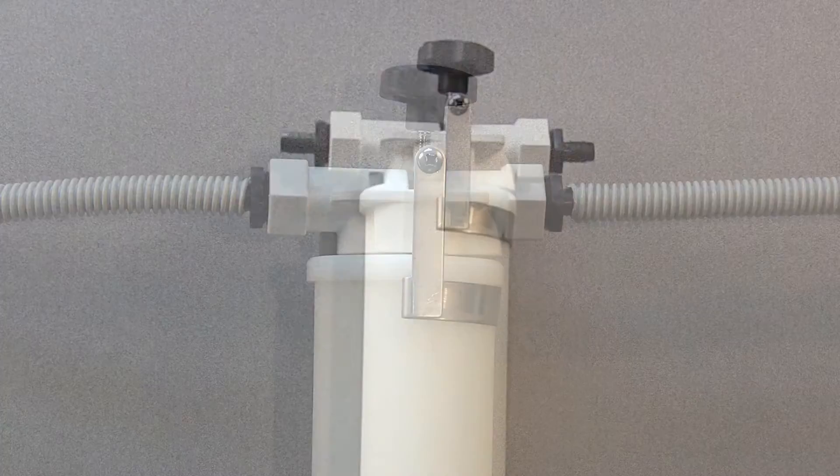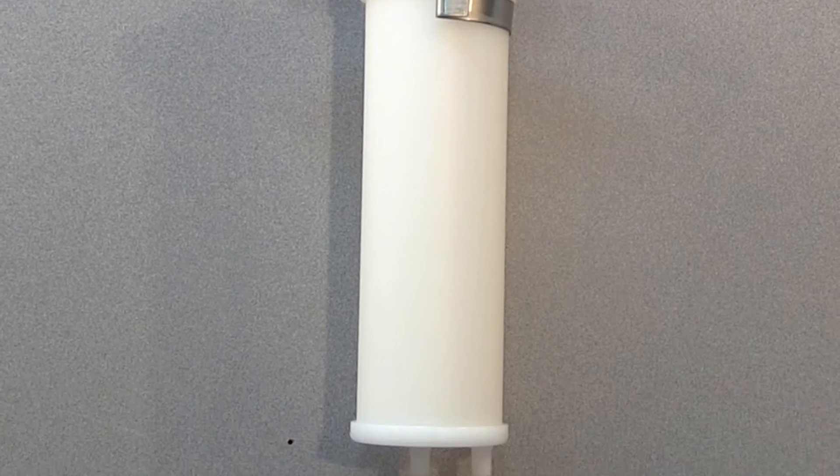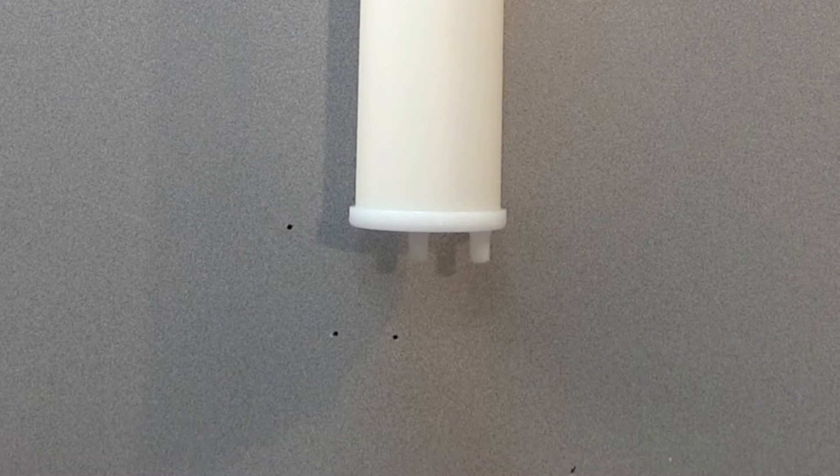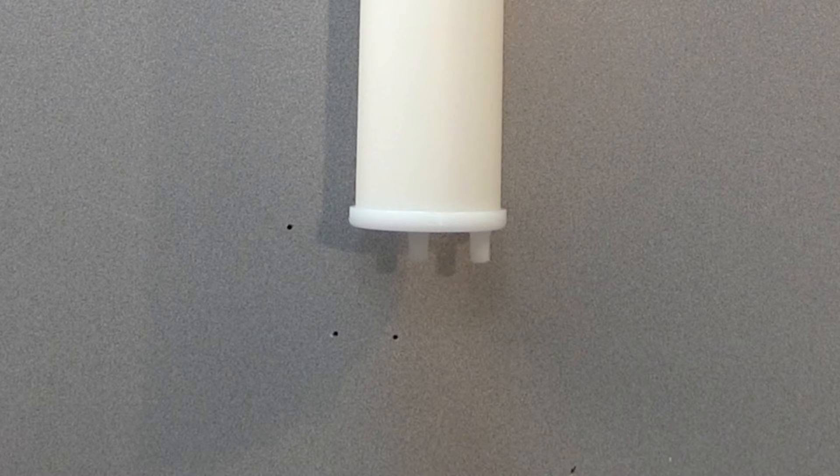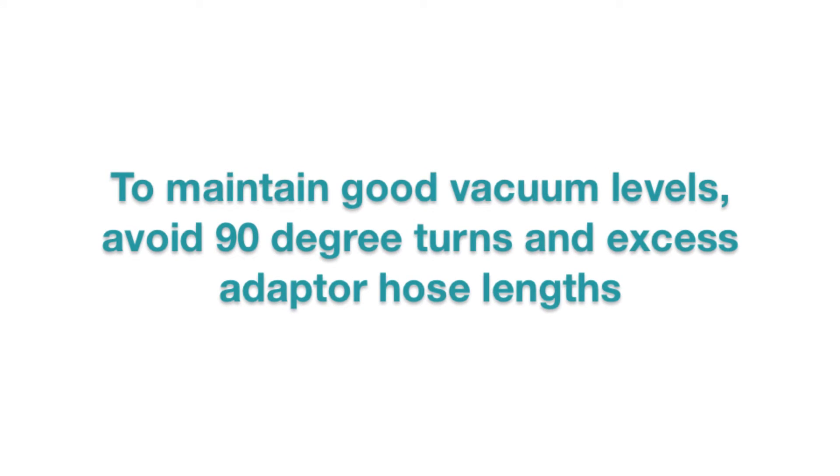We want to mount the separator vertically and with sufficient clearance beneath so that you can change the filter. Installation should be kept simple. Avoid 90 degree turns and excess adapter hose lengths. This way you'll be able to maintain good vacuum levels.